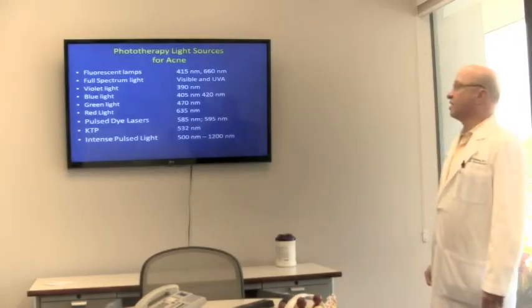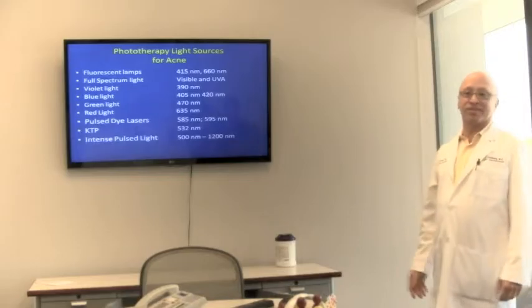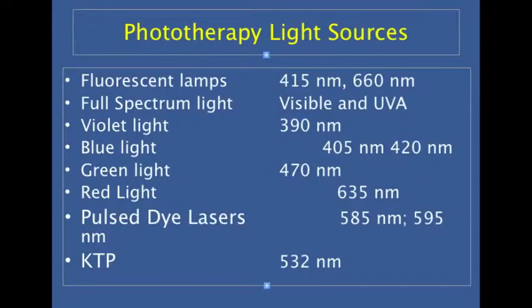Like I said, you can kind of pick your machine, so why more people don't do PDT boggles my mind, because here you're on a mecca where we have a lot of technology, but frankly most offices have something, and it's activated by almost every light source.